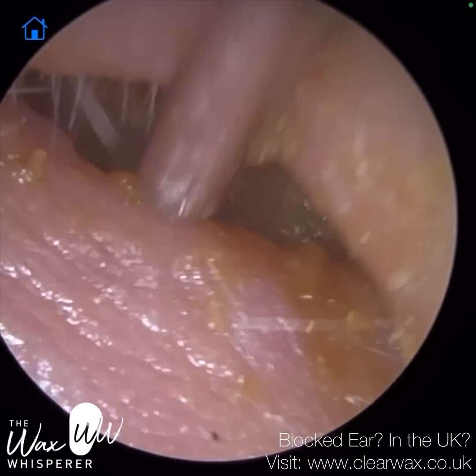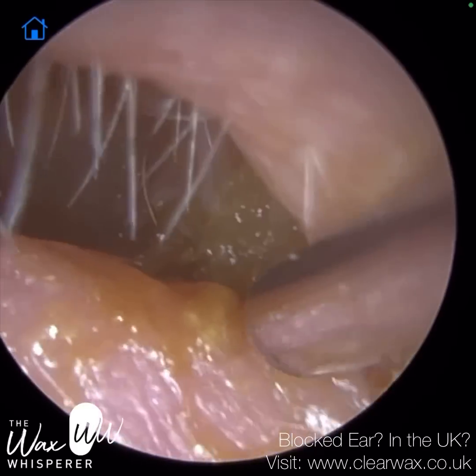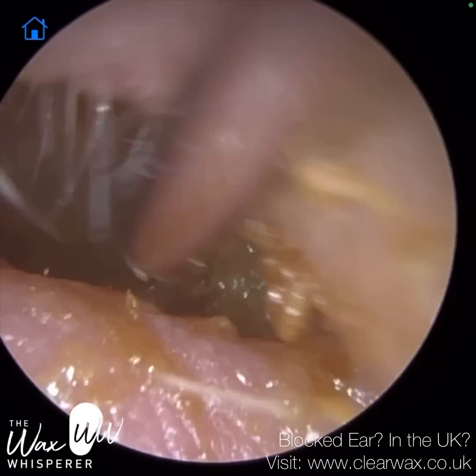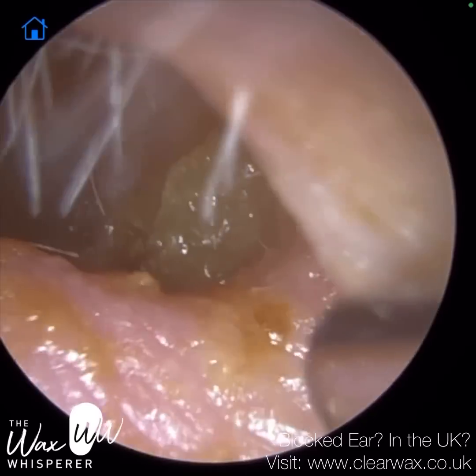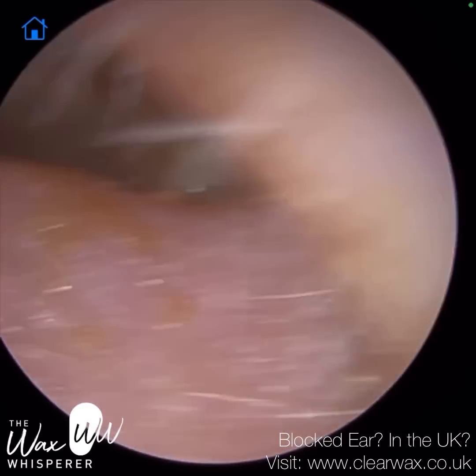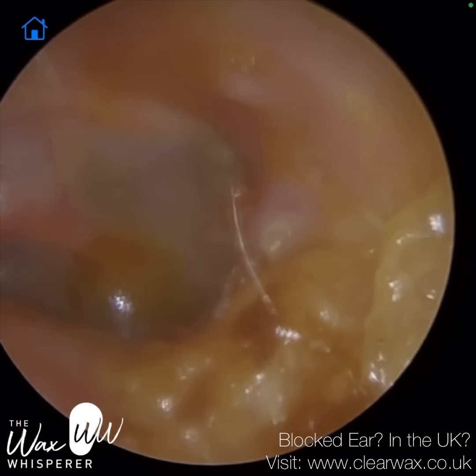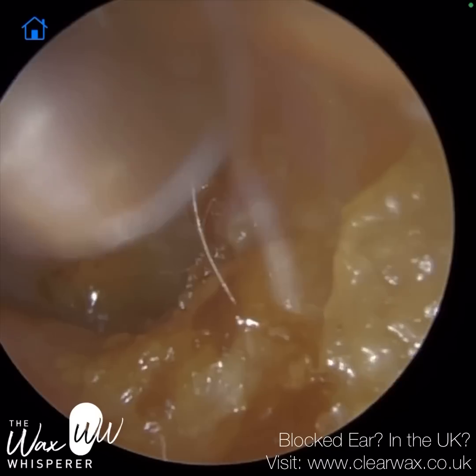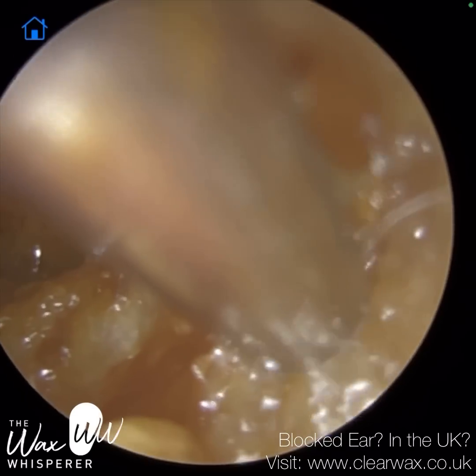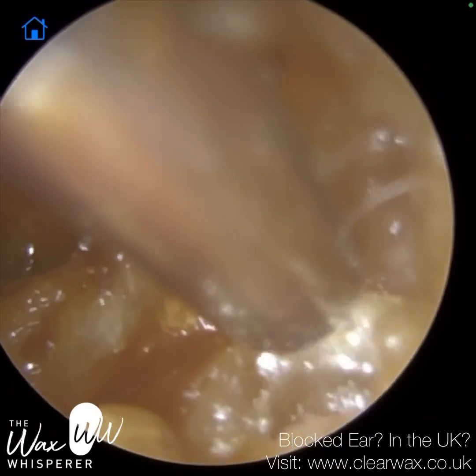And if you want things to be further magnified, all you have to do is insert the endoscope a bit further into the ear towards the object you want magnified. But with the wax scope, it's like an operating surgical microscope — the optical lenses are outside of the ear. So with an operating ear microscope, you have a zoom function, and you can magnify deeper into the ear.